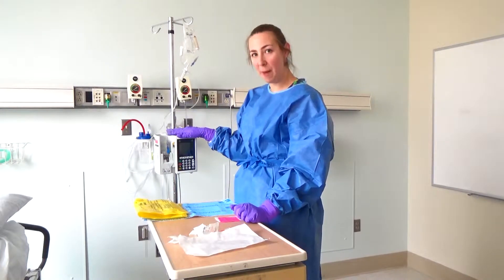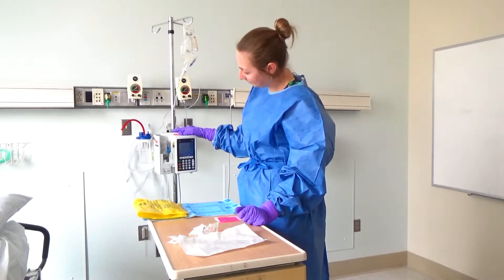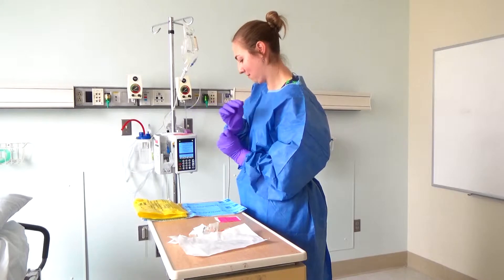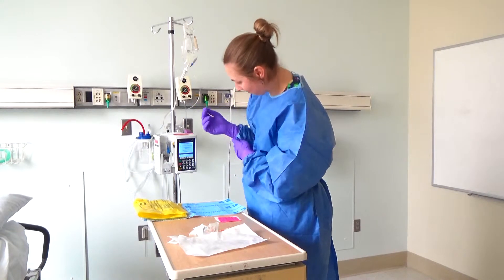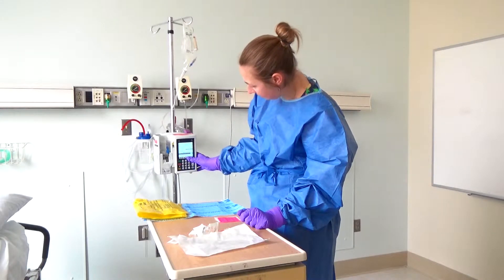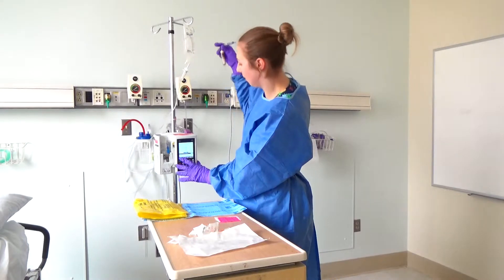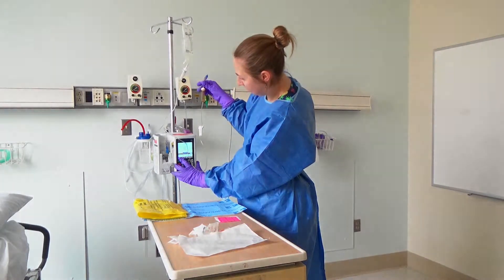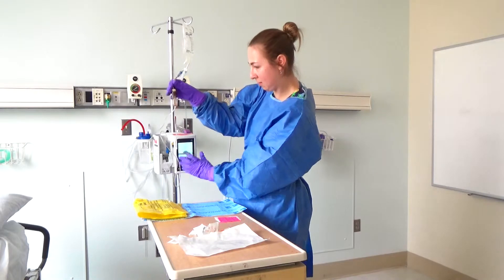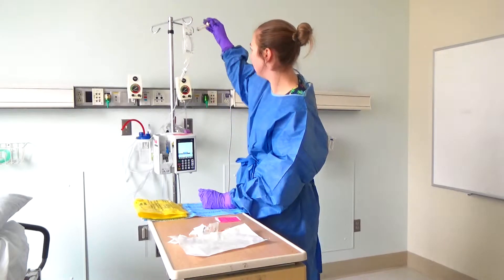The next step is to turn on the pump and prime the pump. Notice this doesn't have any saline in it, so that's where I'll start. I'm going to make sure we're on the oncology section, and then I'm going to use the back prime feature to prime this tubing. You'll want to make sure that you prime it just to the chamber. Then I'll clamp my tubing and hang it kind of out of the way.